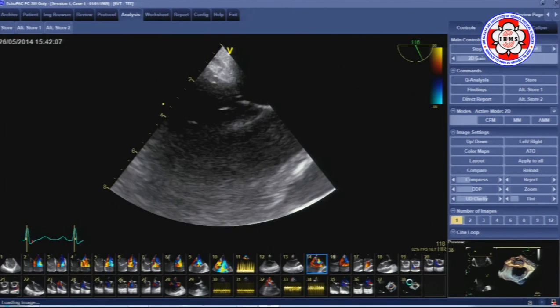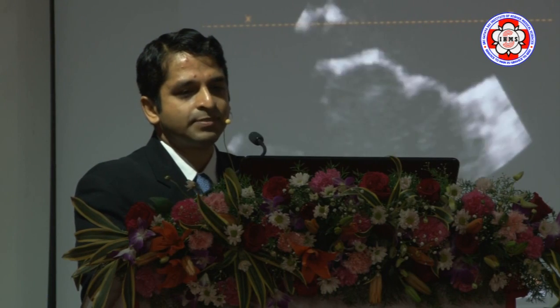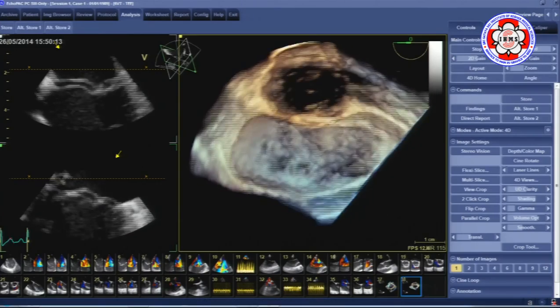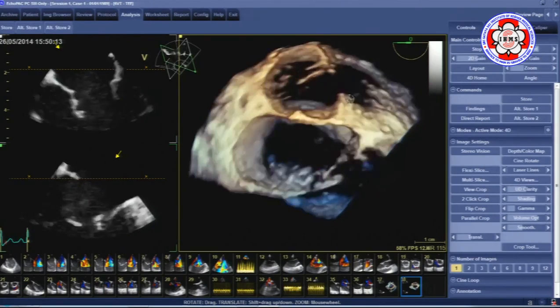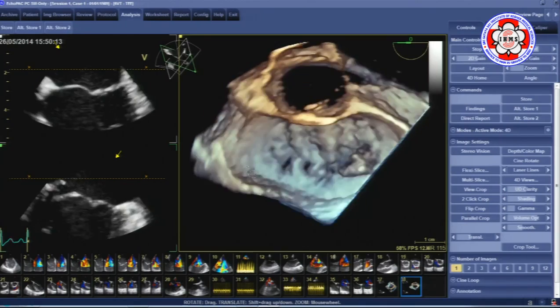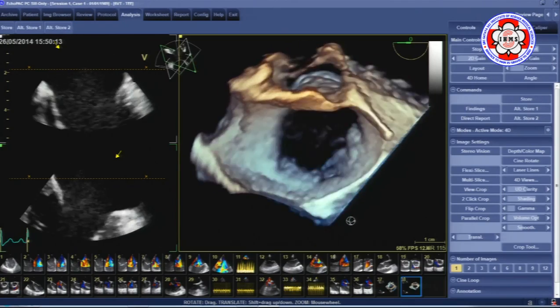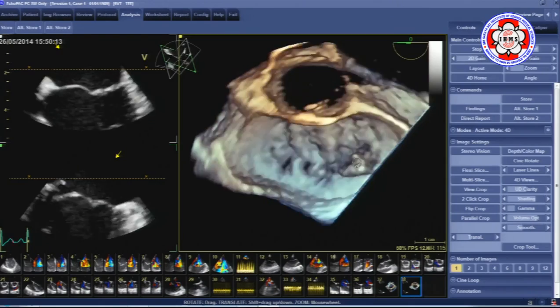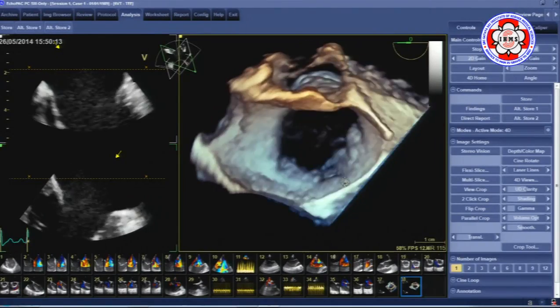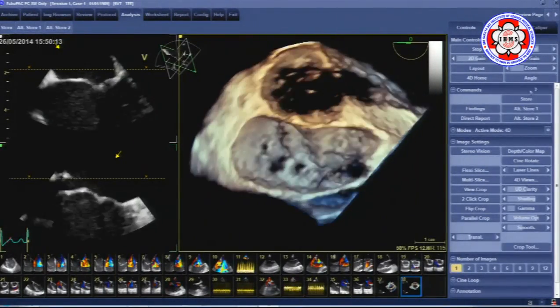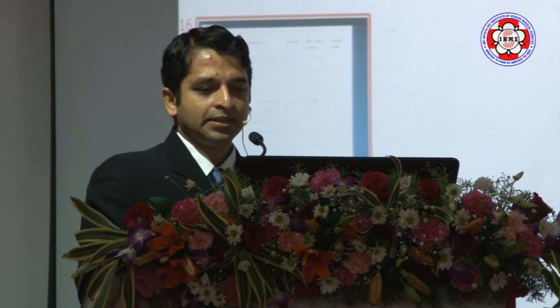So when we have the possibility, we do a 3D TEE — and that's what's being shown here. This is much easier. This is A1, A2, A3. This is your aortic valve, your left and right fibrous trigones, and your left atrial appendage sits here. Then this is P1, P2, and P3. So where's the regurgitation? Where's the scallop prolapsing? P3 — this thing coming out here, coming back to you. That's the P3 scallop — isolated P3 prolapse. We would measure the annulus and tell you it's quite feasible for repair.